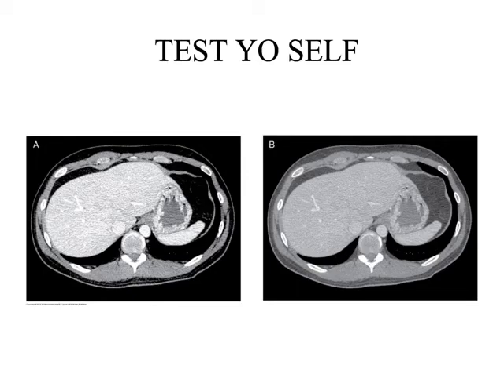Why do you say that? Because it's more gray, so it's lighter than it is dark. Good. And the lungs are still black, the bones are still white. So it looks like we've just changed the window width. We've increased the shades of gray.